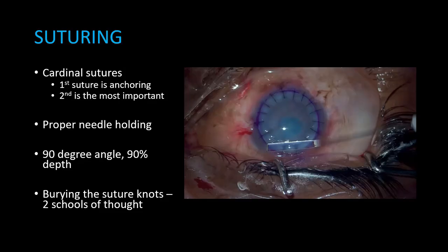And regarding removal of the lens, this patient had a clear lens, and because there was a nice corneal rim around, we could ensure that the anterior chamber is well formed. But when the graft is on the larger side, say 10 millimeter, it might not always be possible. However, try to preserve the lens wherever possible, and also make sure that the anterior chamber is well formed.